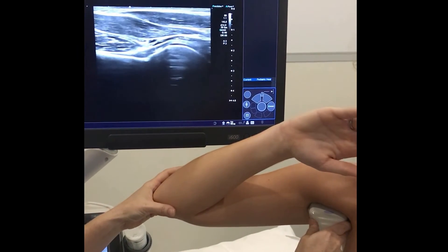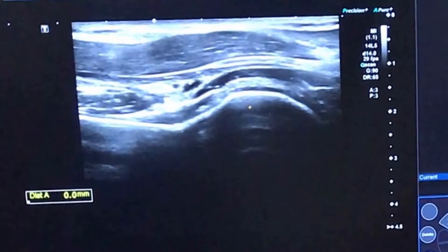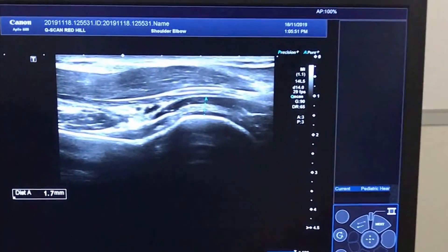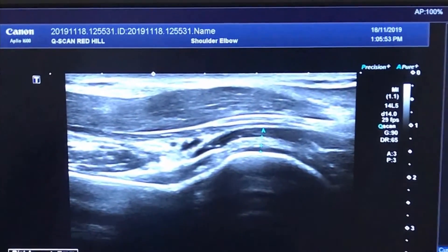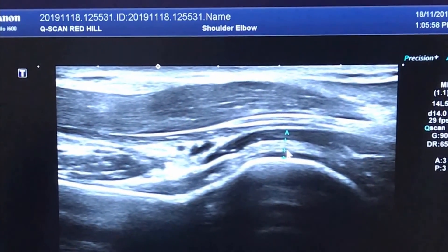The capsule that we measure is this little part here. If you zoom in on the screen, you can see the cartilage over the humeral head — we don't include that. These two echogenic lines are what we're interested in.